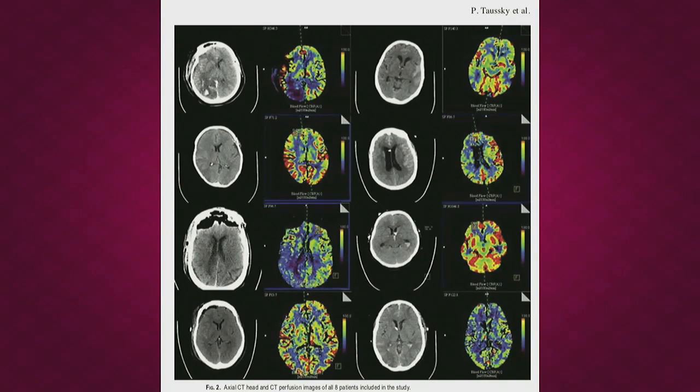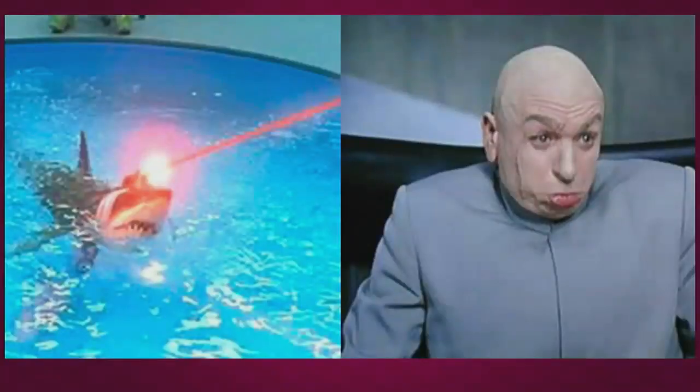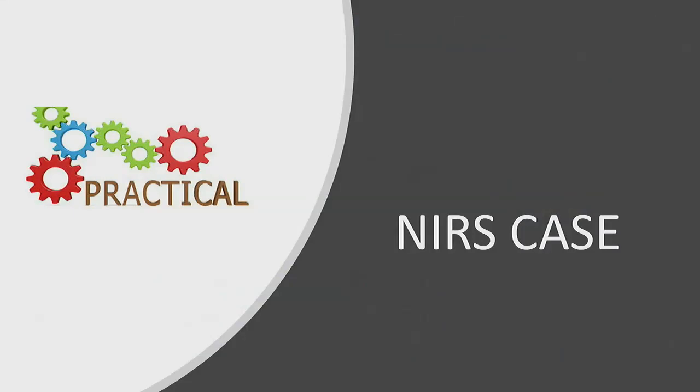One other important number to remember is that most NIRS light with spatial resolution goes down only about 2.5 centimeters. That's it. Now, you can configure larger arrays, but you would probably need to shave the head. So that's an important practical limitation. So yes, laser beams, right? It's really cool. We're here on a Friday, so we're going to move right along.